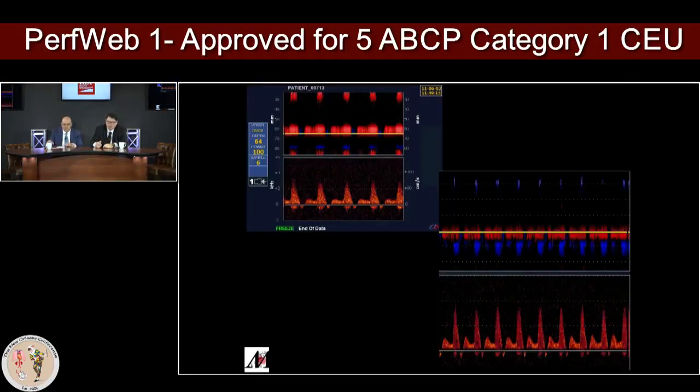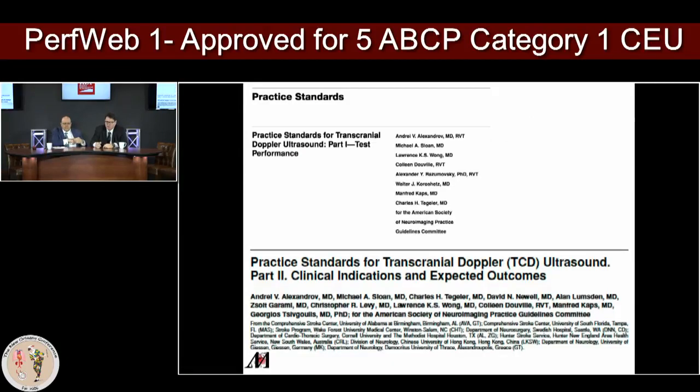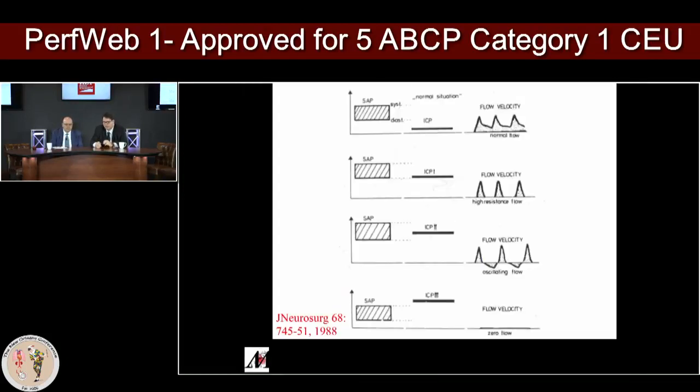These are a few papers on what should be our practice standard, and this is something that we already have, a practice standard for intraoperative monitoring. But I just want to educate about the perfusion. How is a brain perfused? And this is, I think, the easiest example.